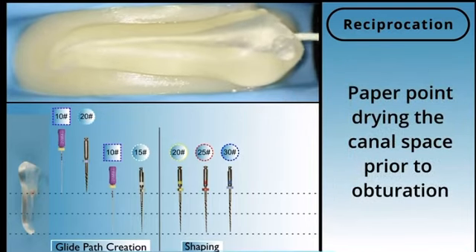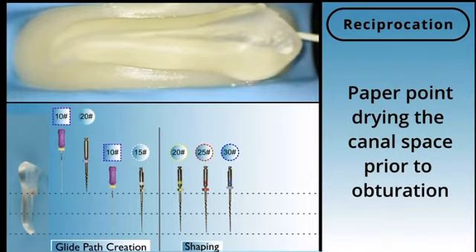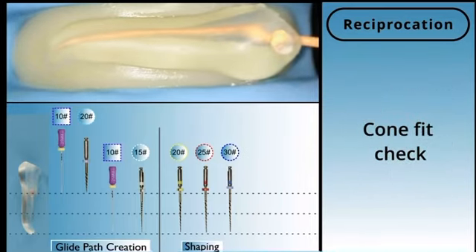Using a paper point to dry the canal space. Cone fit check with the bioceramic impregnated GP cones. Looks like a nice fit. And again, like with the rotary, we're going to use the one fill bioceramic sealer.